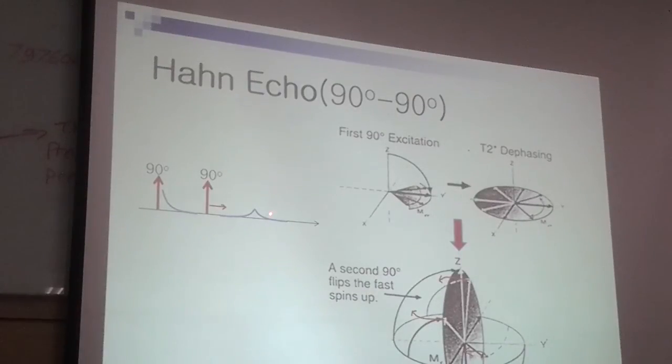This is a kind of RF echo which comes from the double 90-degree RF pulses. So the difference between this echo and the spin echo is that this echo does not use the 180-degree RF pulse. So we call this echo the Hahn echo. Hahn is the name of a famous person who studied the famous Hahn echo in the MRI field.